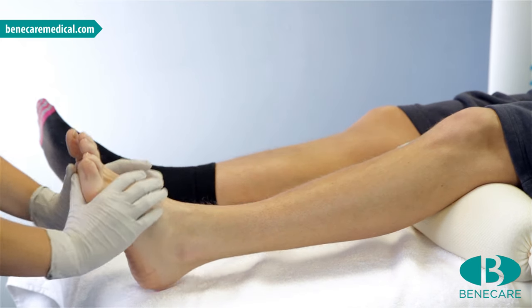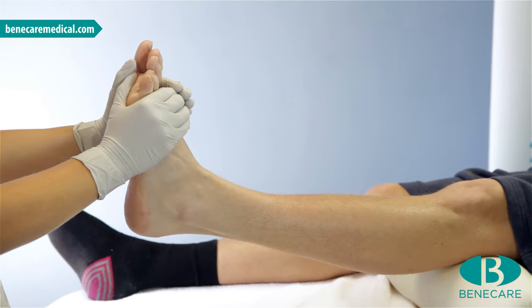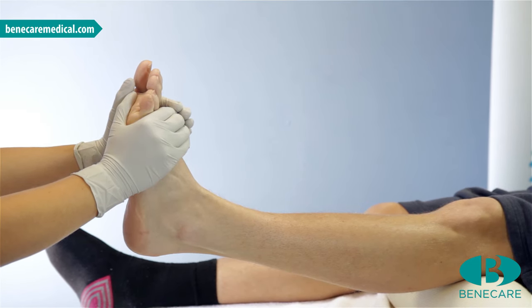Position the limb appropriate to the indication and maintain this throughout the application. On this occasion it is in a neutral position with the ankle at 90 degrees.